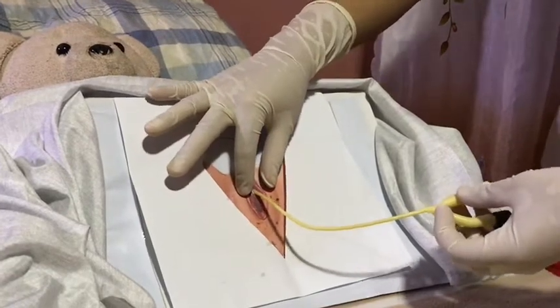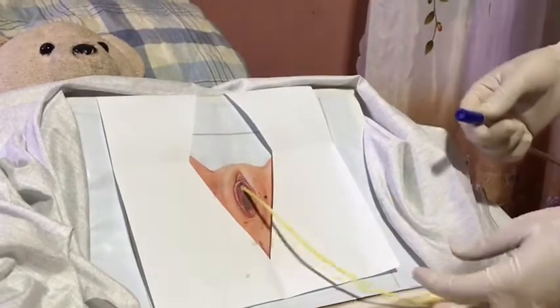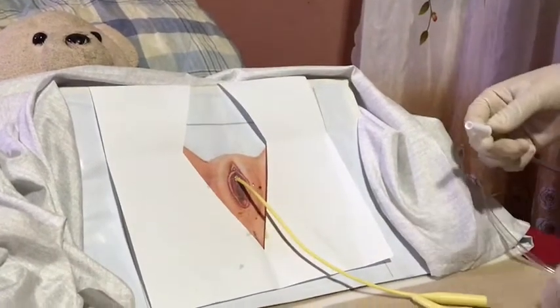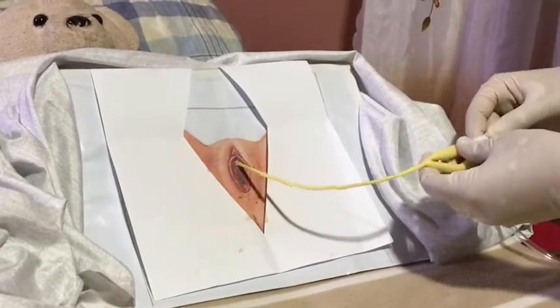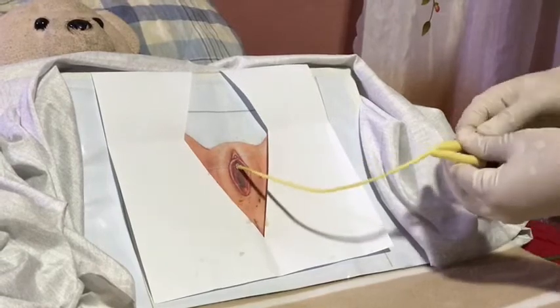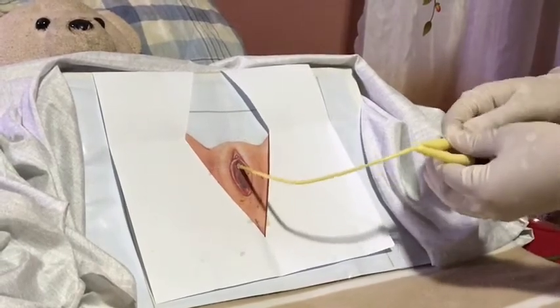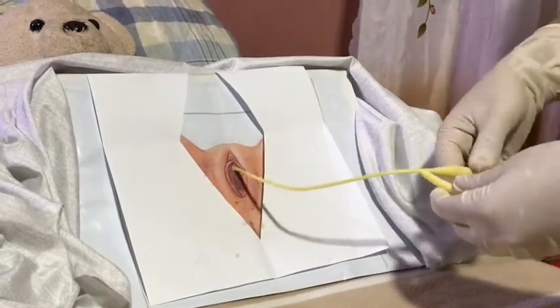Now connect the catheter to the urine bag. Now secure the connection of the urine bag to avoid the leakage of the urine.